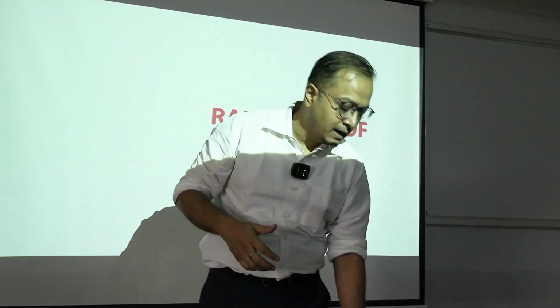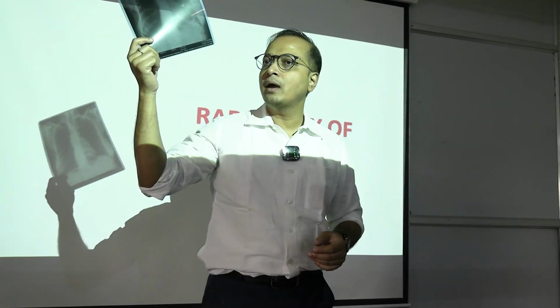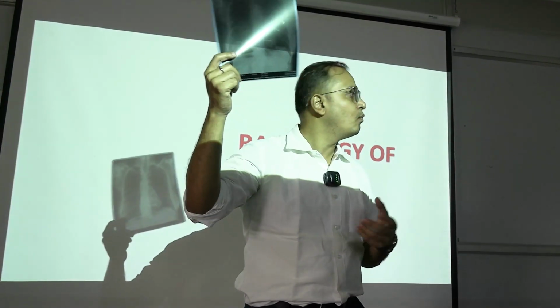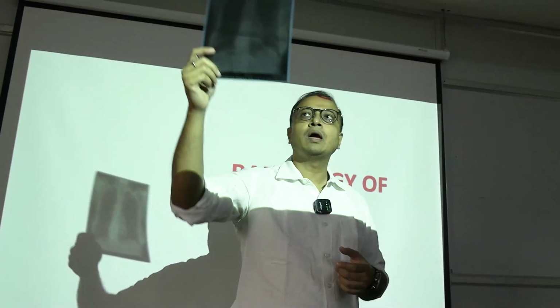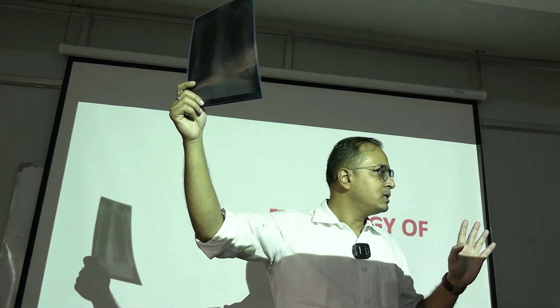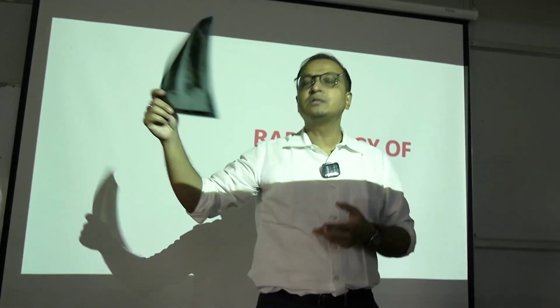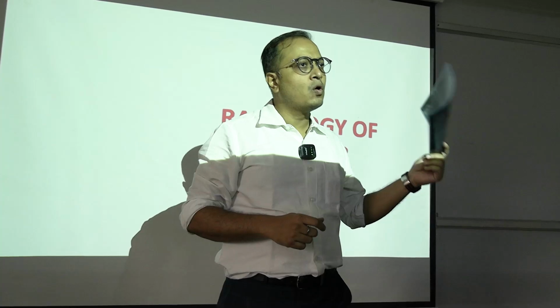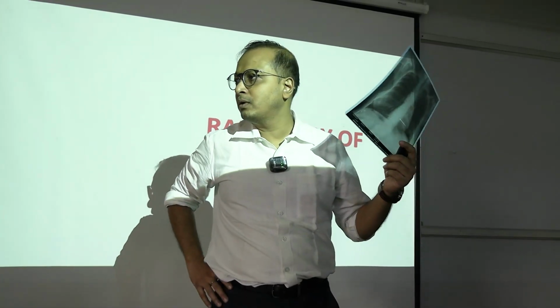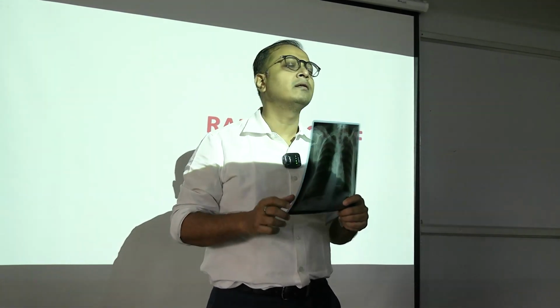So, whenever you are getting this, these are not color plates. These are black and white, or a mixture of black, gray and white. So, we have three shades here. We are getting the black shadows, we are getting ivory white shadows, and we are getting what we call gray shadows. So, these are the normal things that we see in this region. We are going to see some bones and cartilages, which is the osseous shadow, which is commonly taken.